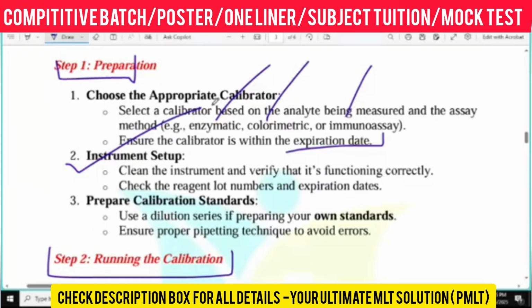If you are using any kind of standard as a calibrator, then you have to prepare it. You can prepare it yourself in the laboratory, or you can purchase it commercially. Getting my point? If any calibration requires a standard, you have to choose the standard, and you can prepare it in the laboratory or purchase it for running the calibration. Okay, understood? That's all for the preparation. You have to do the preparation first. Are you prepared? Understood up to this much?